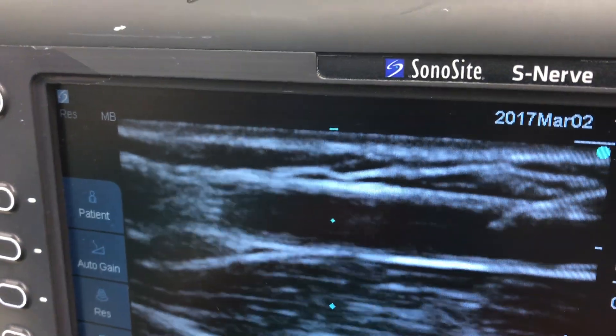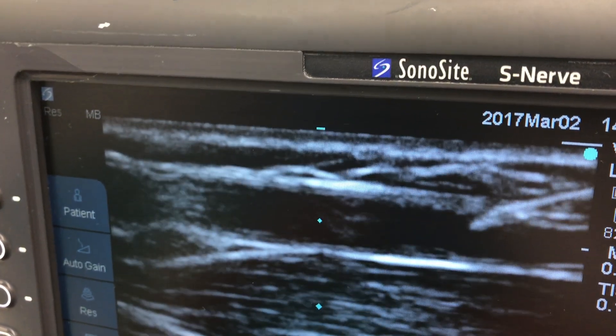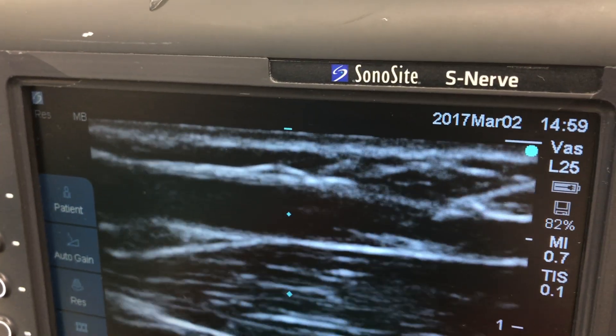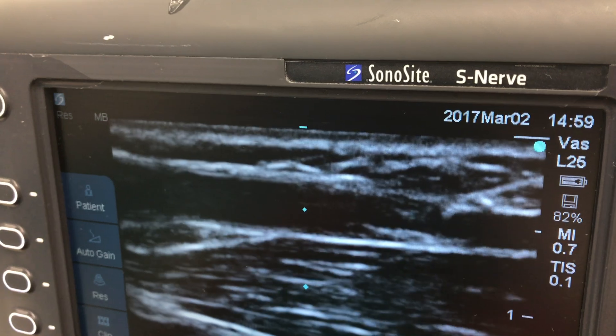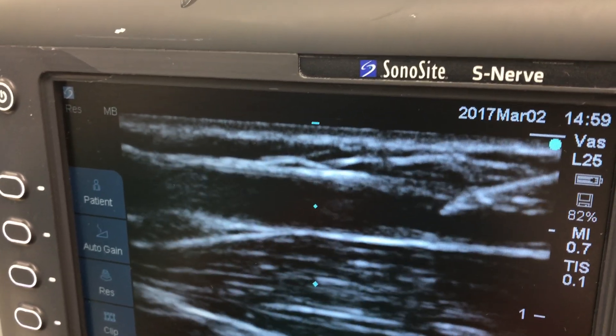I like to scan to both sides to see if I get a sharper picture of the needle on either side of the vessel. Here they seem to be the same, but when I move a little bit to the right the image is a little bit sharper, so I'm aware that I might just be a little bit off to the right of the vessel.